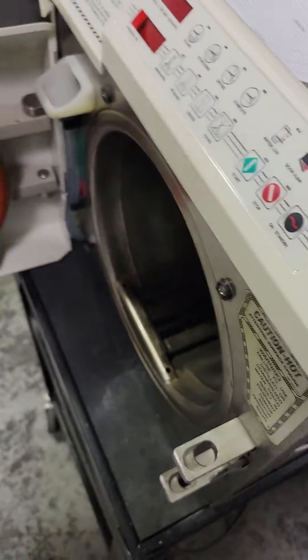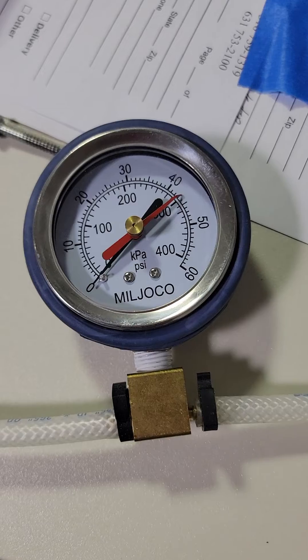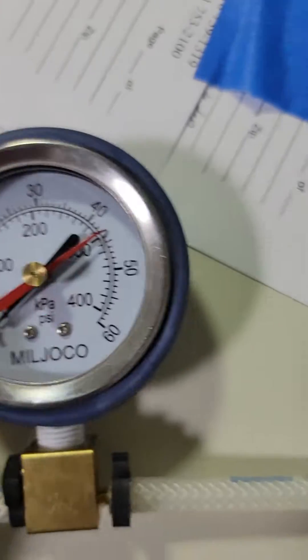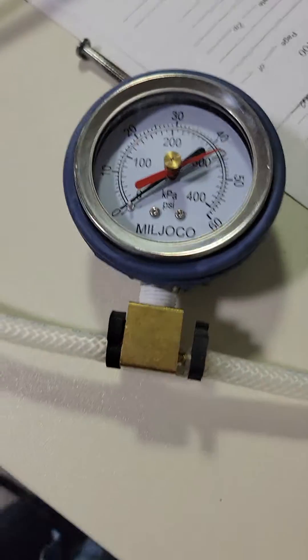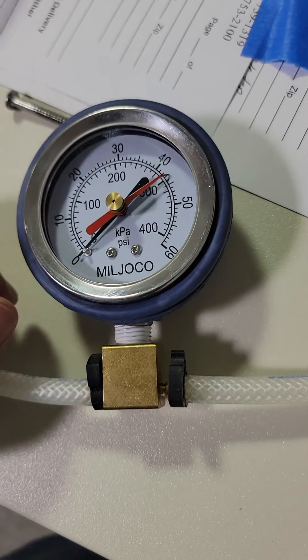Pressure testing on a Midmark or any automatic autoclave. This is the gauge that comes with the Midmark kit. You can buy any fluid pressure gauge — just make sure the scale goes up to at least 40 PSI so you don't blow the gauge. If you're going more than 40 PSI, you're going to blow your safety relief anyway, so that's as high as you need to go. Midmark does a 60; these are cheap, you can buy them anywhere.